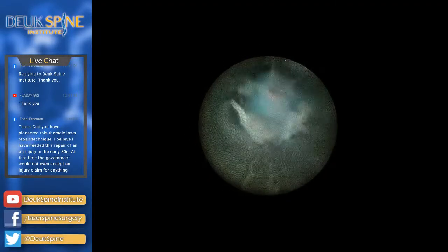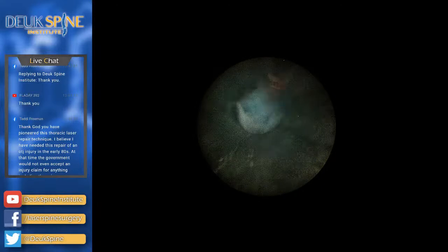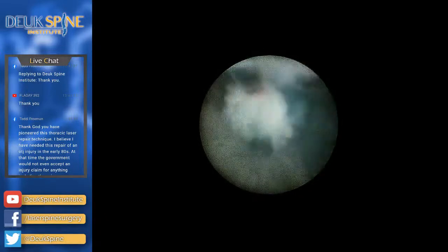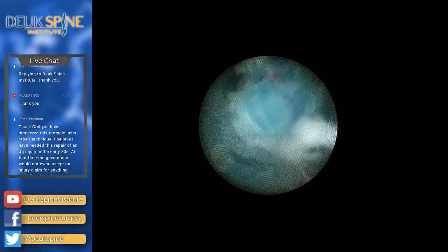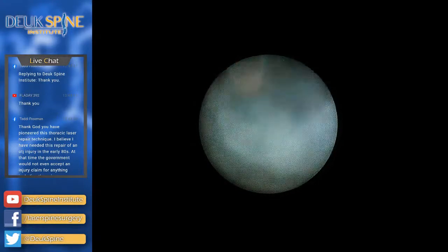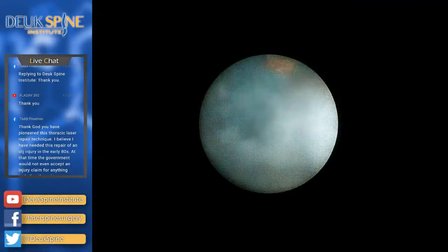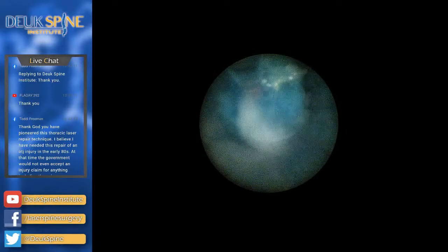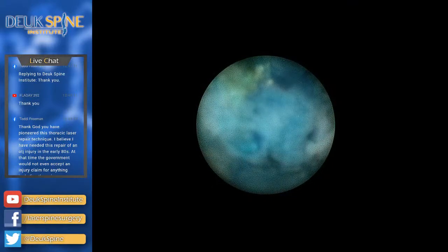Really good. All right. Still some herniation there. It wouldn't come out with the grabber, so we're going to go in after it with the laser. I have a pedal. Are we ready to go? Are we on 20? Yes, we are, sir. All right, so now we're going to debulk this herniation using the laser. I've turned back the power just a little bit compared to the lower back, and I'm getting it now with the laser. This is all herniated disc right here. And I pushed it back into the disc so that I could get it out safely from inside the disc. I pushed it in there with the dilator. Does that make sense?